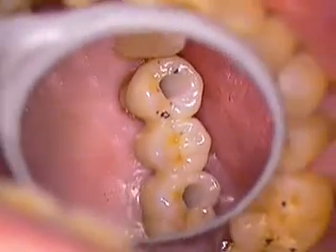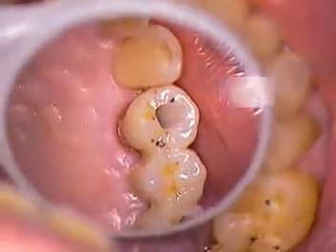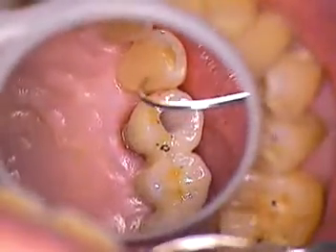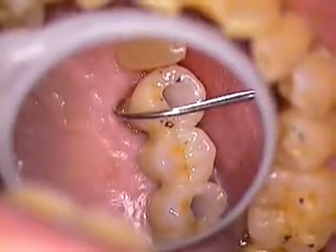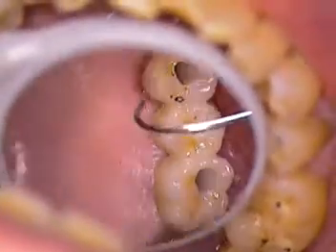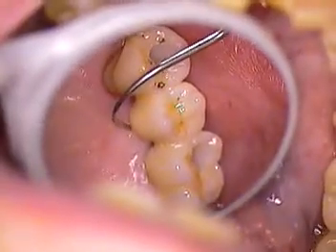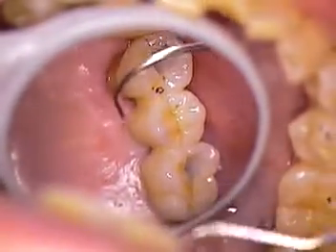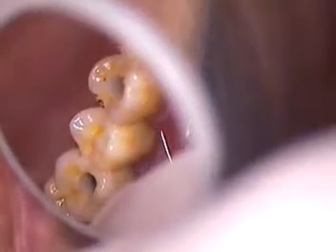Let's just take a little guided tour here of the linguals. She did have some recession on the palatal side of number five, and just a little bit here. Could have come from the temporary itself, but it seems to be fine on the x-ray, so we're in good shape there. Here is our pontic. We asked our lab to give us a little bit of pressure in that area so food wouldn't get caught. We did instruct our patient to use a water pick.